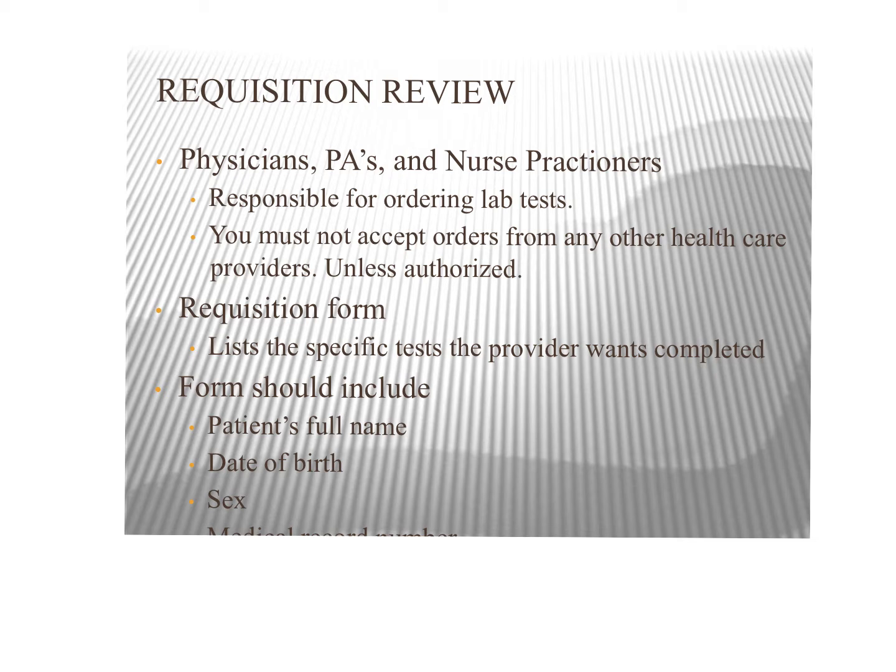A requisition form is going to be the form that lists all the specific tests that the provider wants you to draw, so what they ordered. That's where we learn later down the road, okay, these tests are ordered, which color tubes do I need to use? And the form should also include the patient's full name, their date of birth, whether they're male or female, and then their medical record number as well.